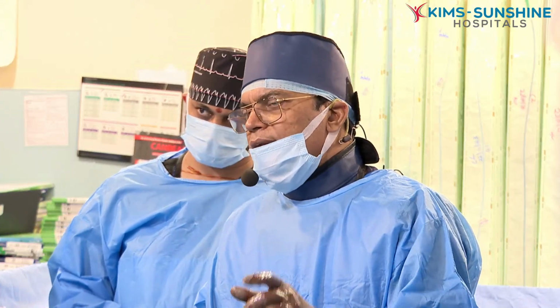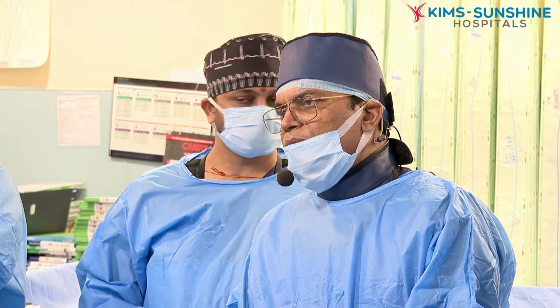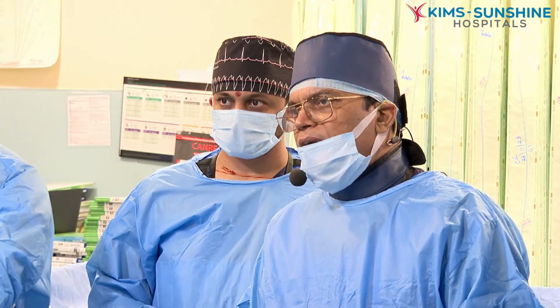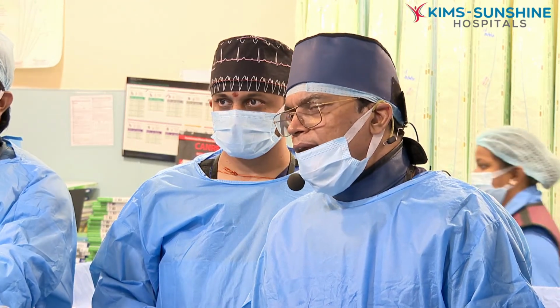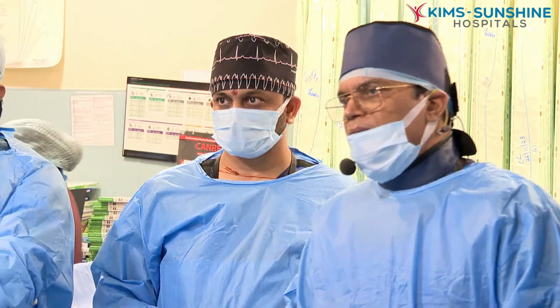They consistently showed significant reduction of stent thrombosis and reduction in the TLR. Even the death rate is also less when you use it. Indirectly, see the plaque modification. If plaque modification is required, do it. Once you do the plaque modification device, check whether it is adequately modified or not. Otherwise, you have to upscale the plaque modification devices.